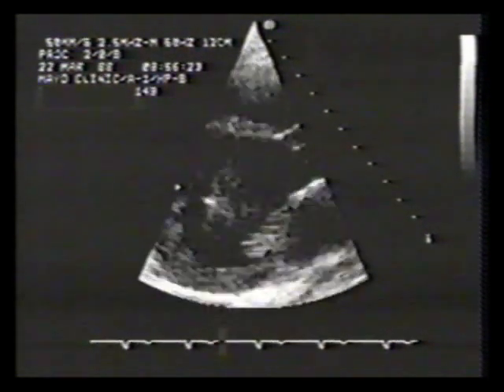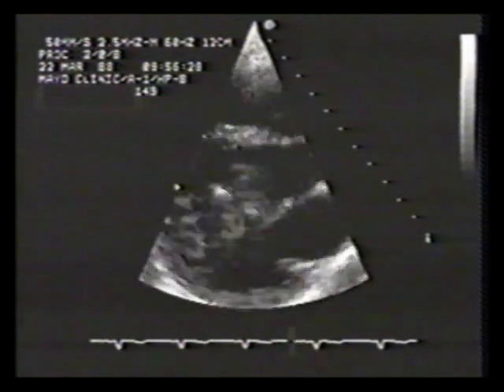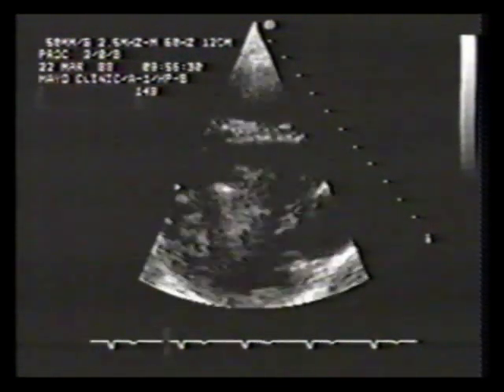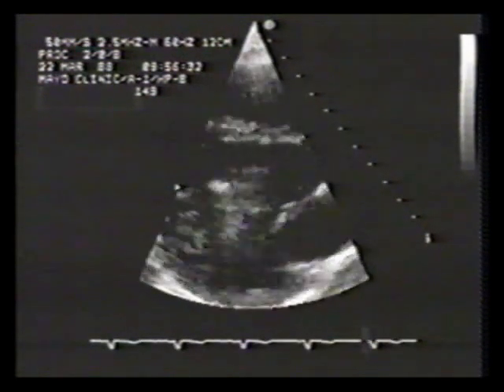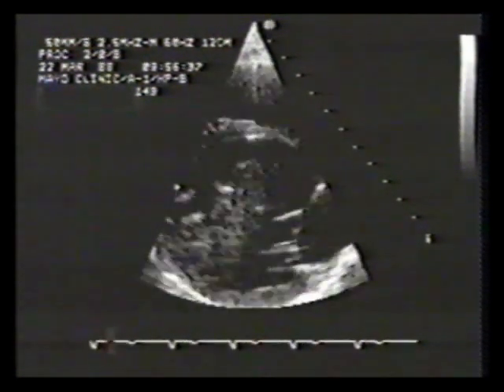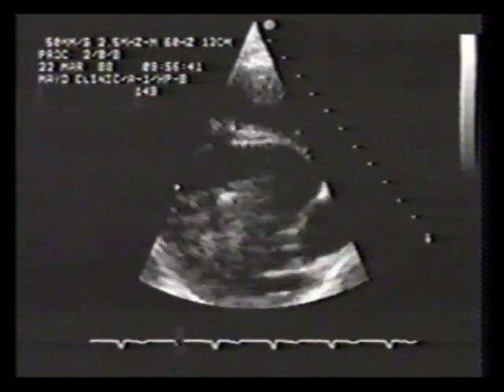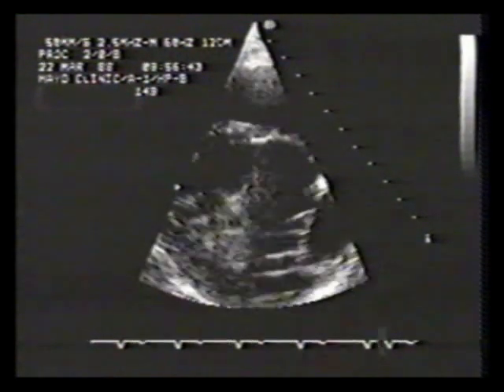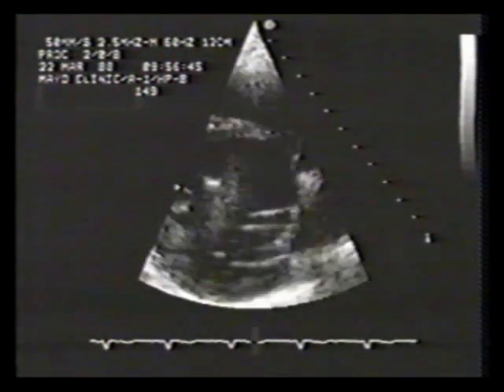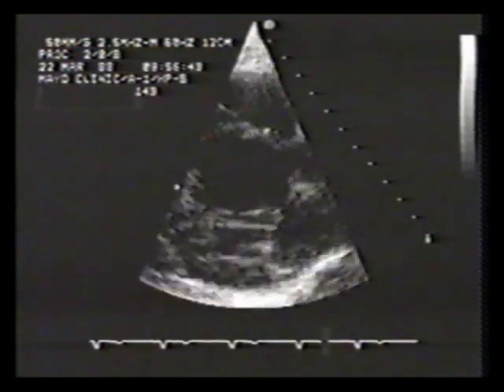This mass of echoes does not appear to be adherent to the underlying endocardium and at times crosses anatomic planes. Various techniques are utilized to discriminate artifact from true intracardiac mass. Various depth settings, frequencies, and transducer positions should be utilized. Notice that the mass does not conform to any of the morphologic features of masses heretofore mentioned on this tape.